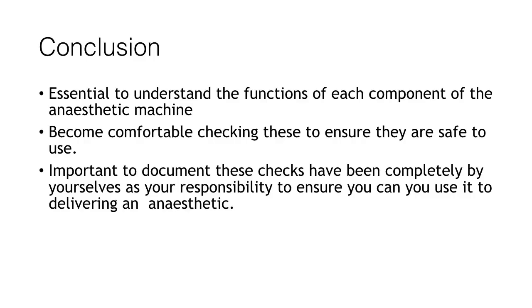So to conclude, we have gone through each step of checking the anaesthetic machine in turn, and I hope I've explained to you some of the functions of each of the components of the anaesthetic machine. You should continue to practice checking the anaesthetic machine so you become comfortable with it, and it's also important to document that you've done these checks in the notes, as ultimately it is your responsibility to ensure that the machine that you're using is safe to deliver an anaesthetic.